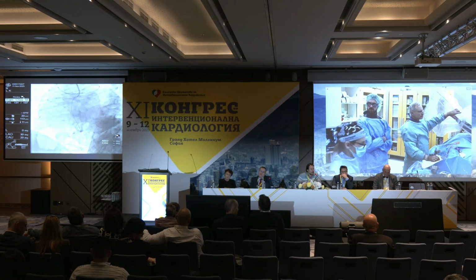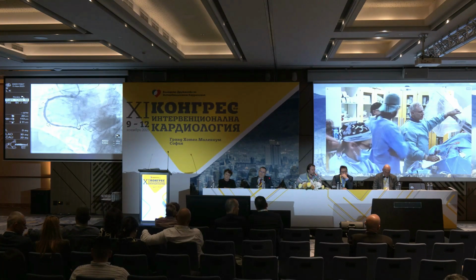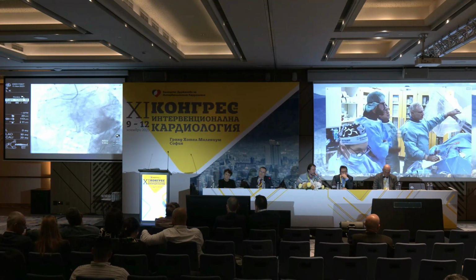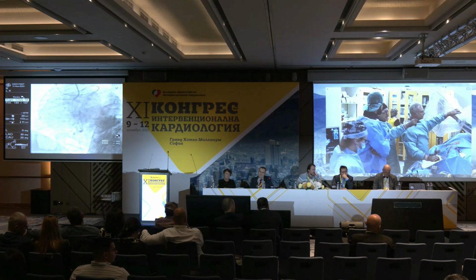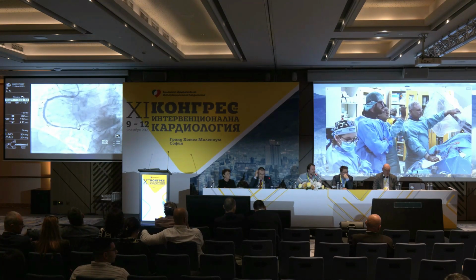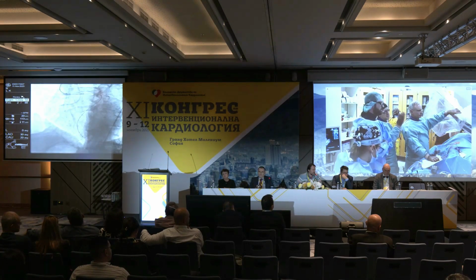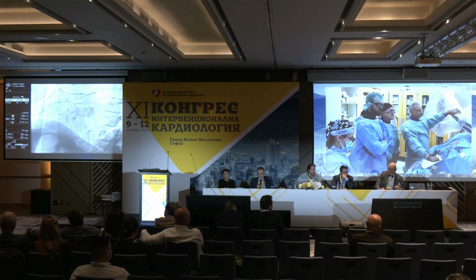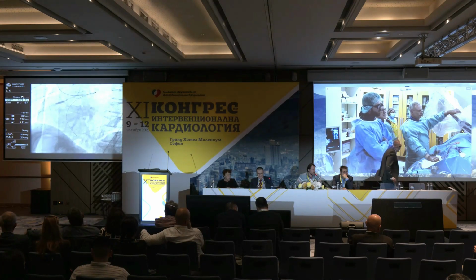I totally agree with you. The 4.5 balloon over there. The 4.5 balloon was clearly. No, what we saw is when you inflate the balloon from the first stent that we employed, it's an ALS2, staining or probably something that went into this direction, a branch or something else. This thing appeared during that time, but unfortunately we didn't see it.